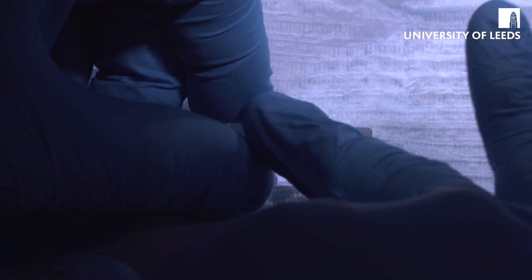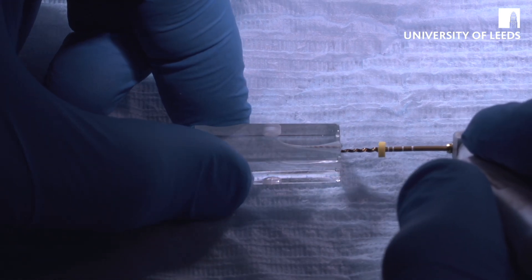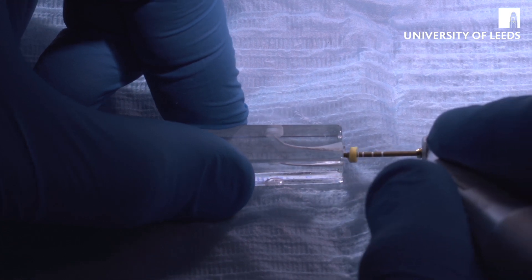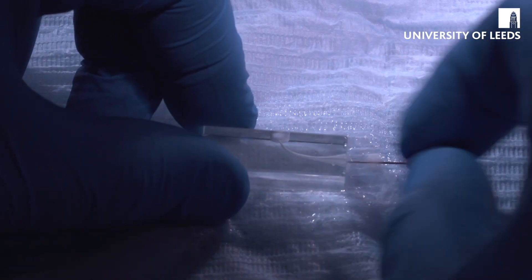Take the shaping file out, irrigate again, get rid of all the debris, patency file the size 10 back in to remove any debris. Then move on to the finishing file — measure it to our determined working length. The finishing file has a yellow band on it. Finishing files are used in a slightly different way: instead of brushing, it's a simple pass to the apex, out again, pass to the apex, out again — then irrigate again and patency file.